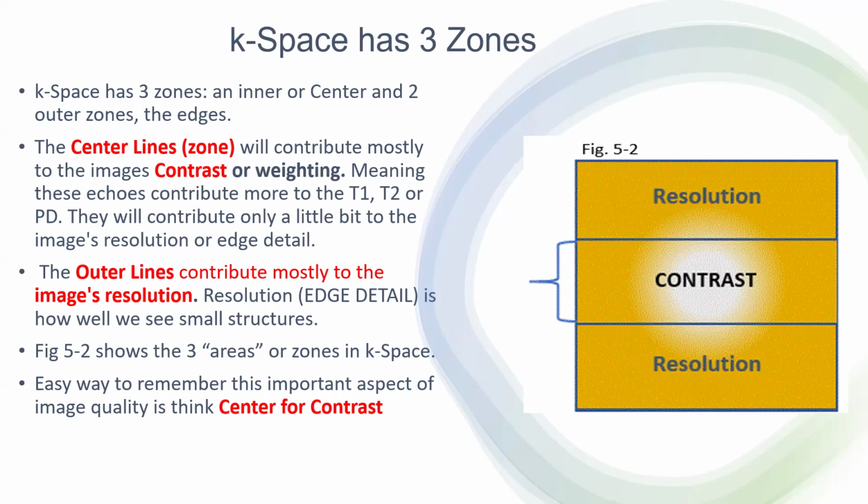Now, I just had a thought, and I'm going to add this in. Here's a question that I've seen asked before. They're going to give you all these parameters, TRs and TEs and matrix and slice thickness, and they can say to you, what is your in-plane resolution on such and such a sequence? And you go, crap, what is in-plane resolution? Very easy.